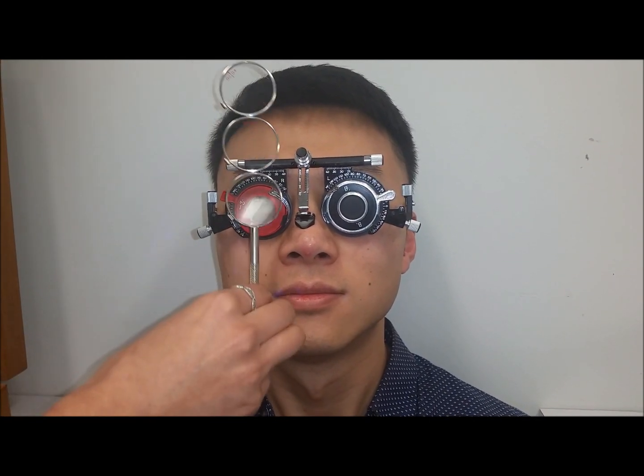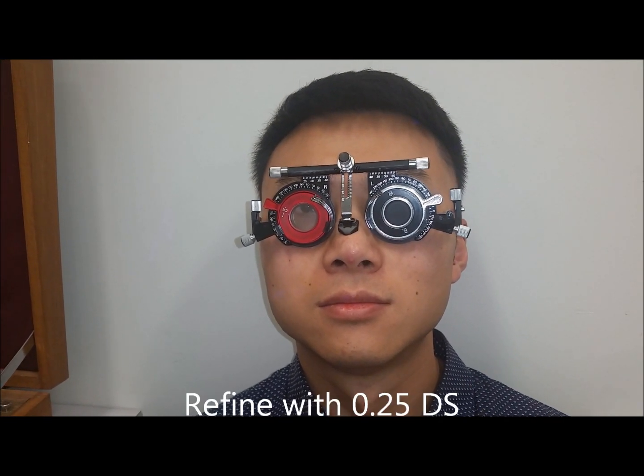Yep, and so I just want you to tell me the same thing again. Is it clearer with or without or just smaller and darker? Just smaller and darker. Because the patient did not prefer an additional minus 0.5 lens, we now need to refine using a 0.25 dioptre sphere lens.